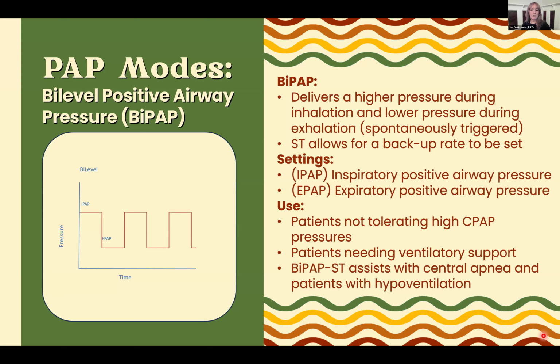We set IPAP and EPAP on those machines. And again, sometimes with a little bit of a ramp, sometimes adding some oxygen in there. Patients not tolerating high CPAP pressures, sometimes we'll go to BiPAP. Patients needing some ventilatory support with that inhalation, exhalation help.